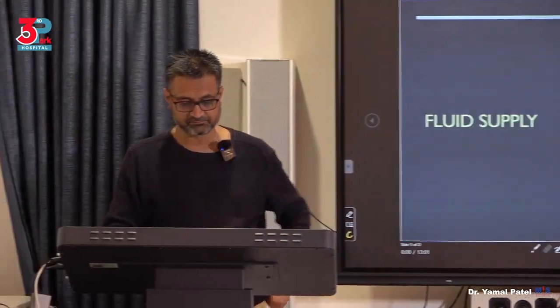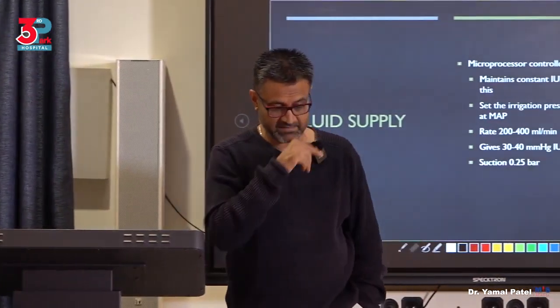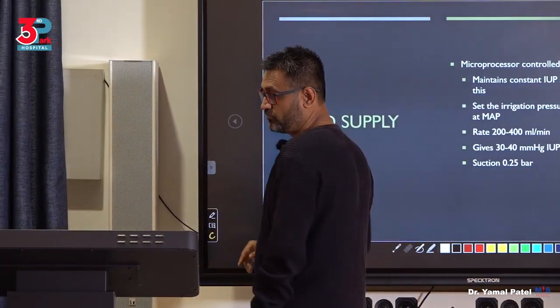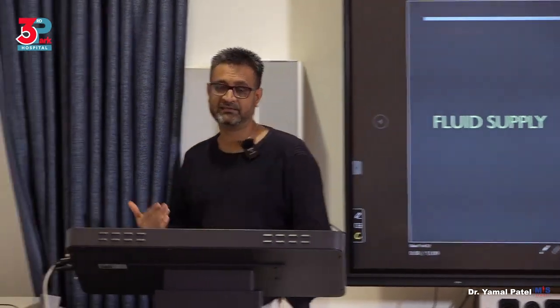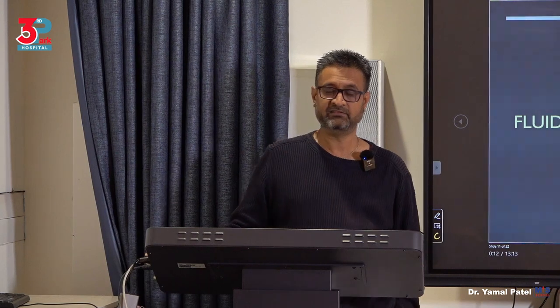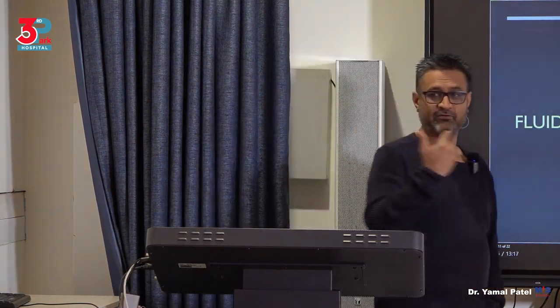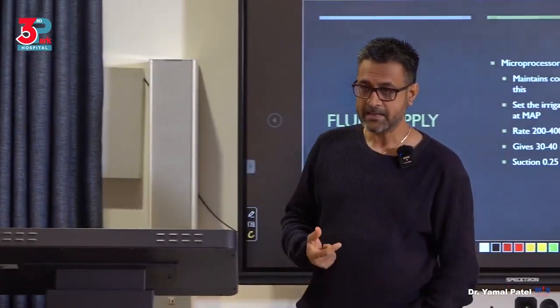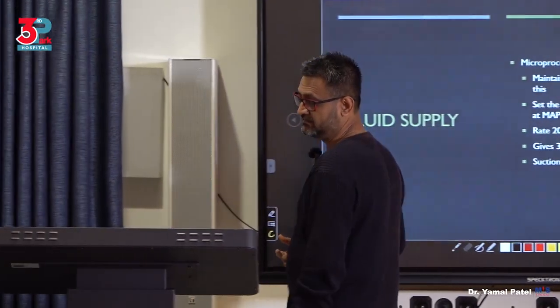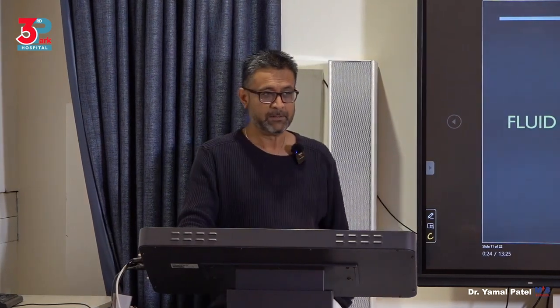So next, therefore, you have something called the microprocessor controlled irrigation and suction pump. So they have been used as different names. We have the Hystromat, the Endomat, etc. Okay? So this is a microprocessor controlled irrigation suction pump.